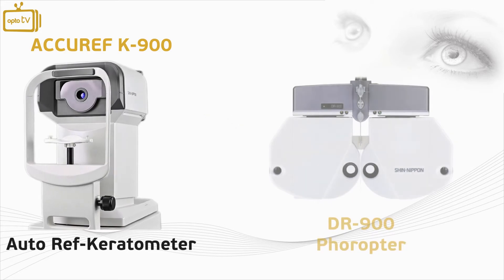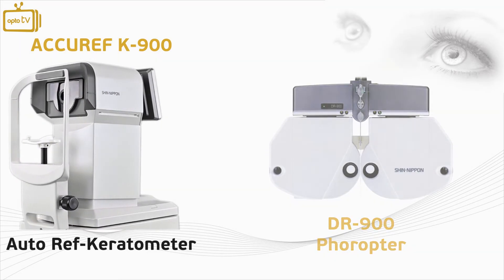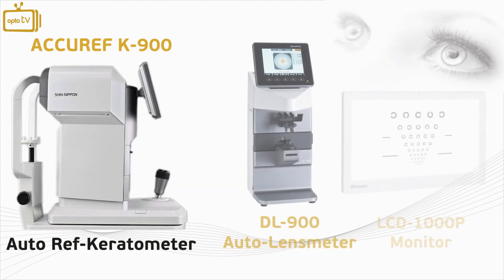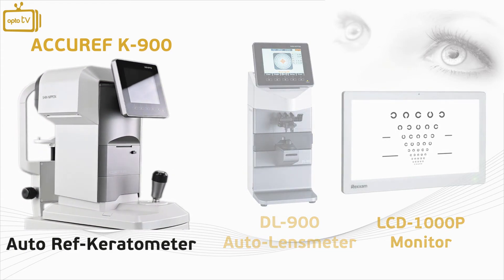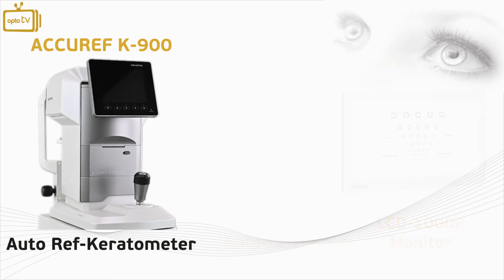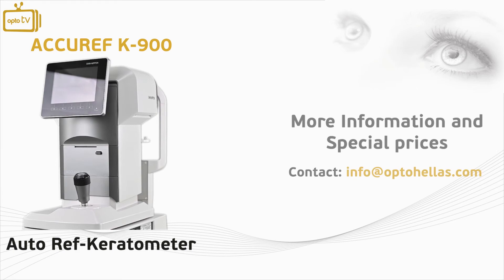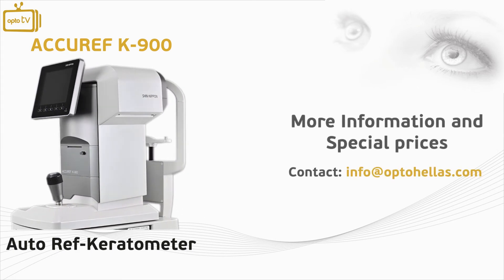The Accuref K900 by Rexxam is part of an ophthalmic system with connectivity. The user can transfer patient data from the K900 to the DR900 phoropter, DL900 auto-lensmeter, and LCD 1000P chart monitor, which are all part of the brand's ecosystem. For more information and special prices, contact us at info@optohellas.com.